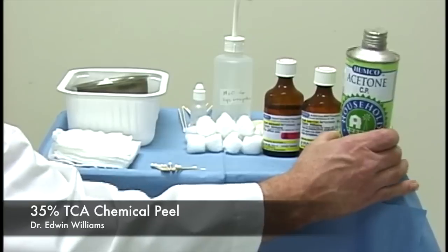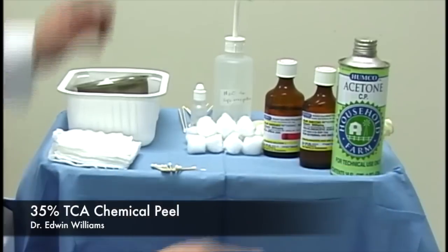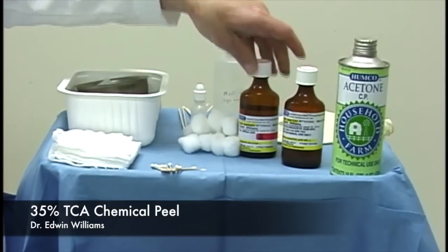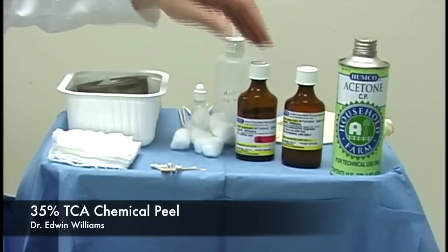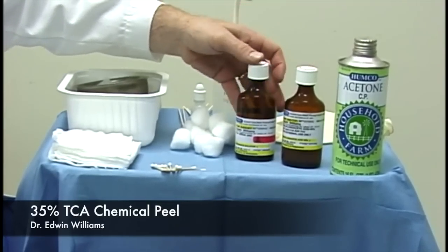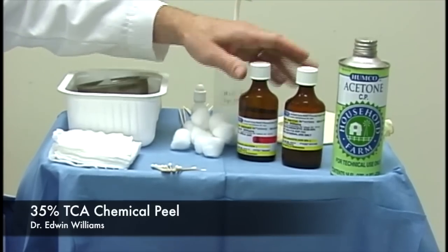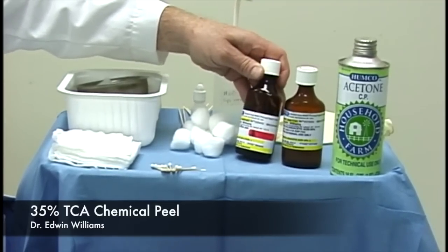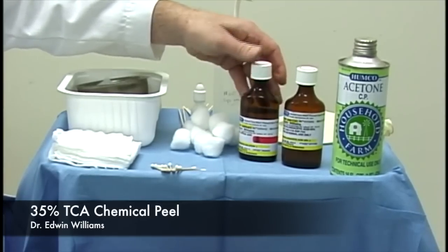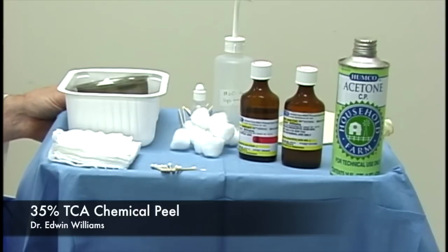Here's our acetone, which we use for degreasing the patient. The 35% trichloroacetic acid—as one begins, you may want to start with a lower concentration, but with more applications and additional time you can achieve the same result. Here's the Jessner's solution; both of these we have formulated on a weight-by-weight basis, and at a local pharmacy you can also order these from dermatologic supply catalogs.